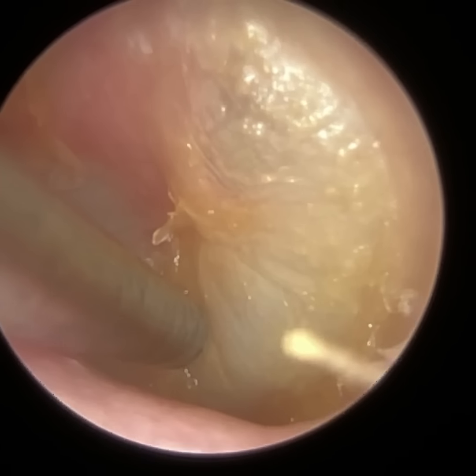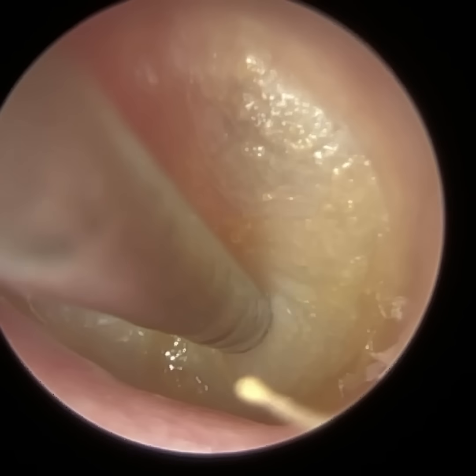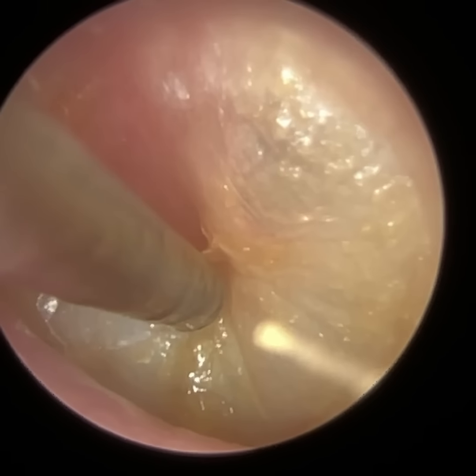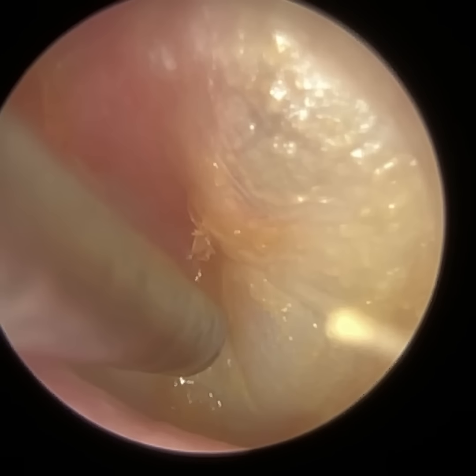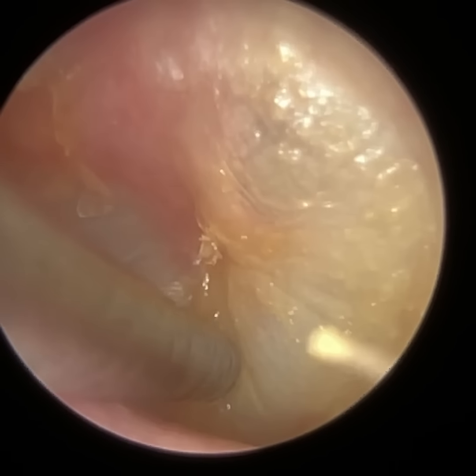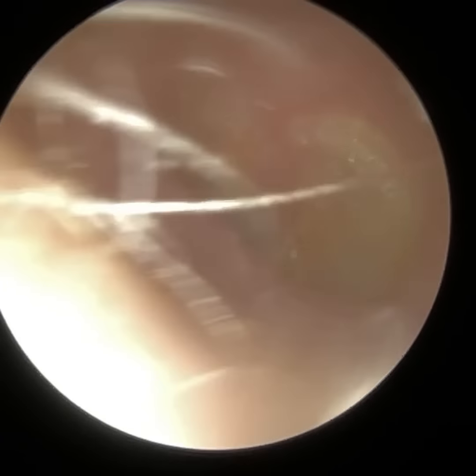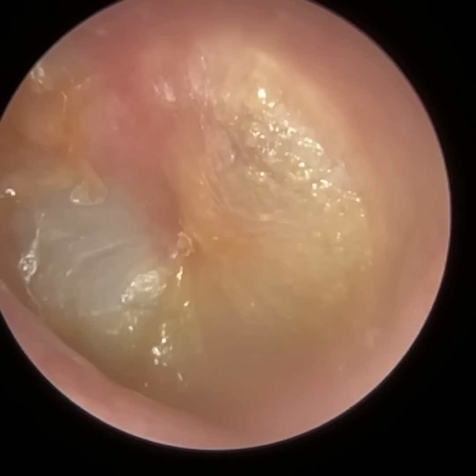And it is super, super thin, this layer of skin. I'm just trying to get a hold of the skin so I can start peeling it, but I did get a hold of it there, but the skin just tore away. I think this is where the patient got a bit dizzy, so we left it.